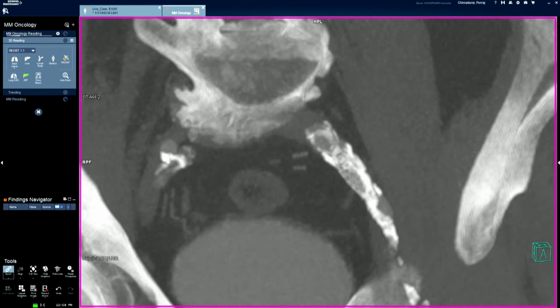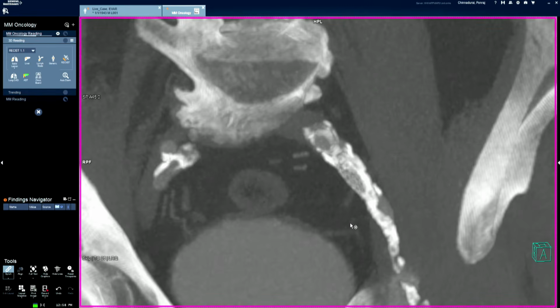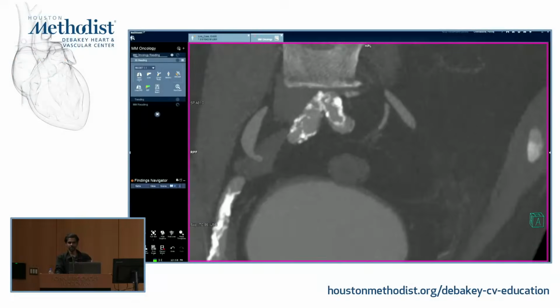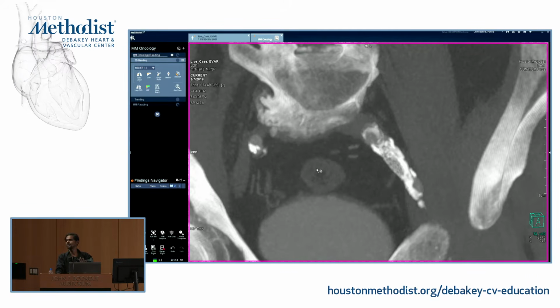So the history behind this: the patient got a cath and got the stent deployed, so we deployed the EVAR device from the right side, just as you suggested. But I'm just showing you how you can use the same rendering techniques. So the way I see this is, do you really have to waste all this time? Just crawl through the axial, go to the OR, step on the fluoro, and you will see the stent.